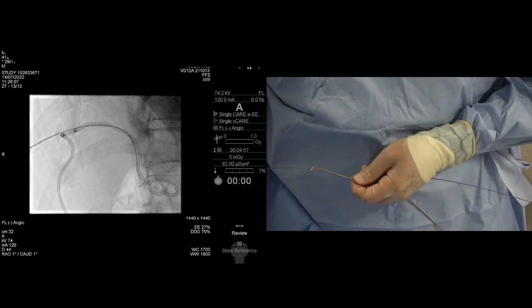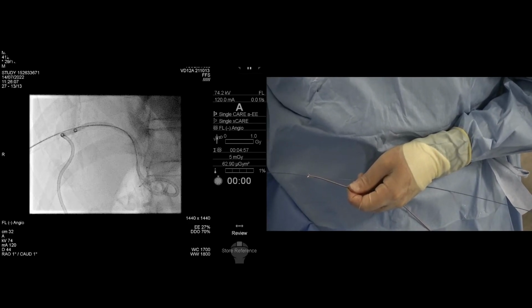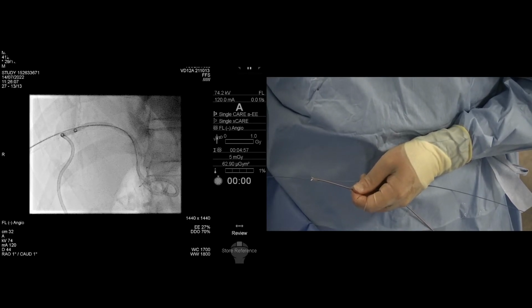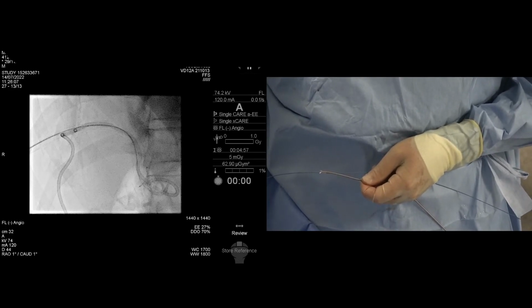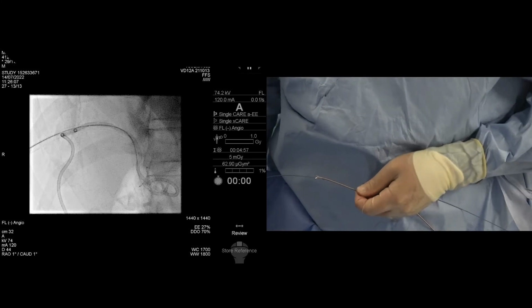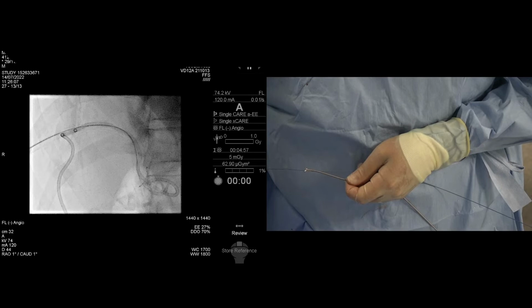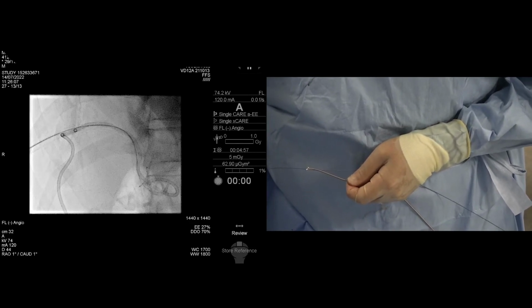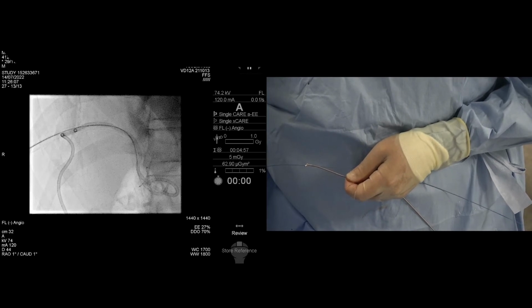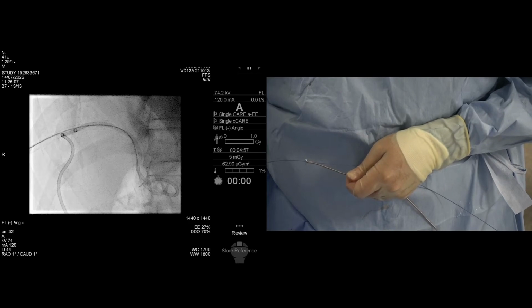We have to be honest, however, that in every setting, a tissue biopsy that includes the local architecture allows the pathologist to much more reliably give us a diagnosis of malignancy or exclude malignancy, because with a biopsy they're able to look for invasion. And so biliary cytology is important, but I think if we can make a histological diagnosis or take histological samples, that's always an important thing to do.